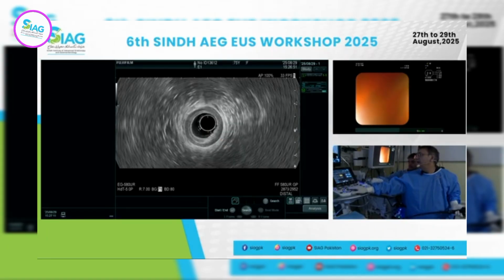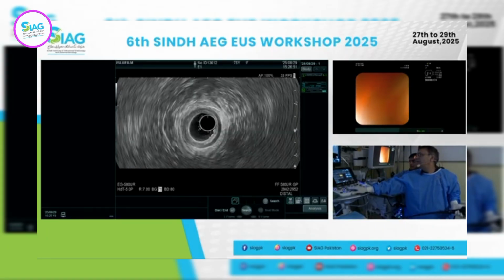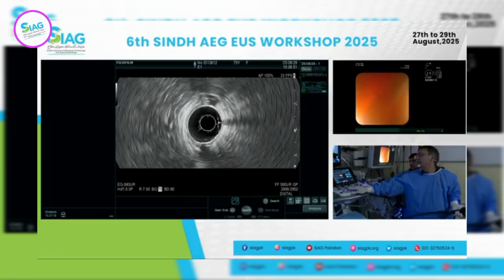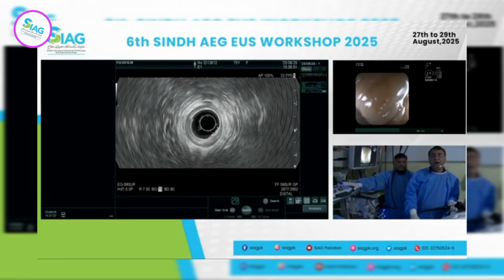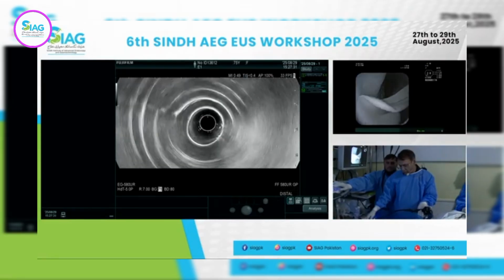Okay. And coming out, coming out. That's inside, coming, coming. Right there, that's where it's meeting the external sphincter. Right there. Okay. We are already out of the anal canal. So, questions?